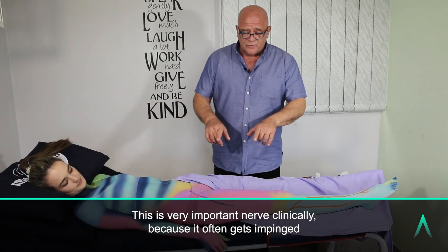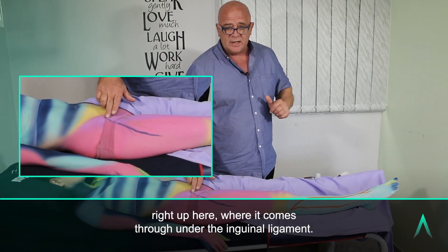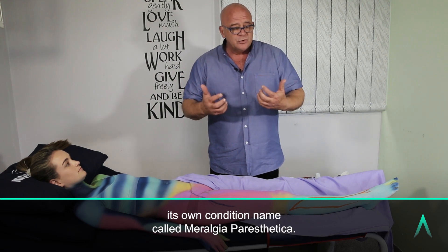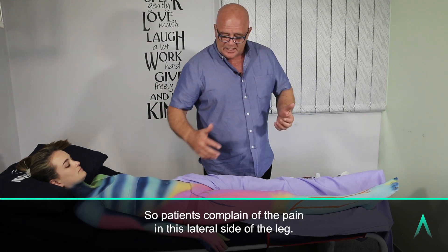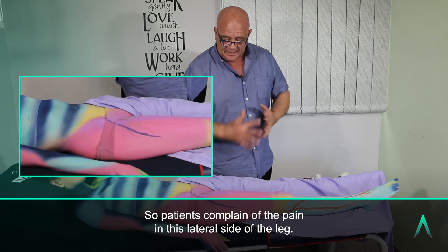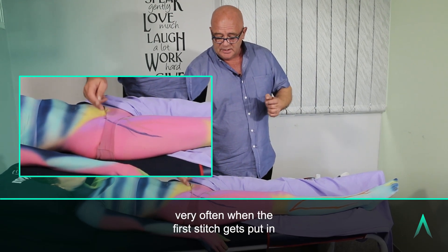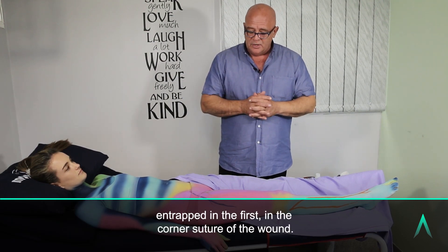This is a very important nerve clinically because it often gets impinged right up where it comes through under the inguinal ligament. This nerve gets impinged so often that it has its own condition named Meralgia Paresthetica, so patients complain of pain on the lateral side of the leg. Also with low abdominal surgery or pelvic surgery, very often when the first stitch is placed, that nerve can sometimes be entrapped in the corner suture of the wound.